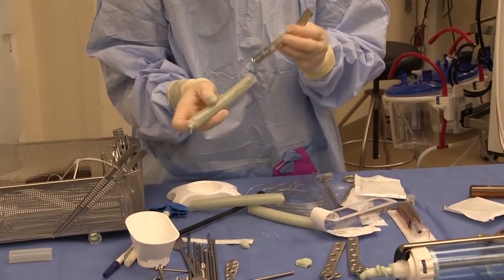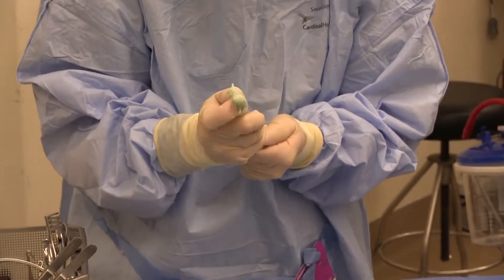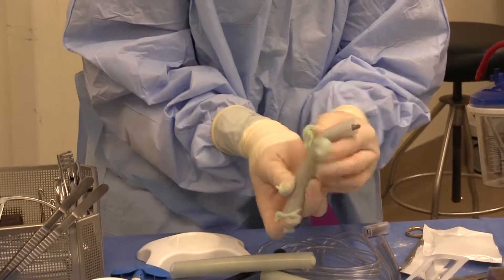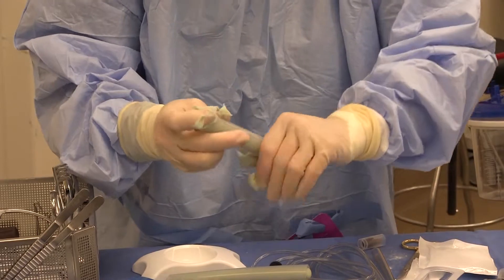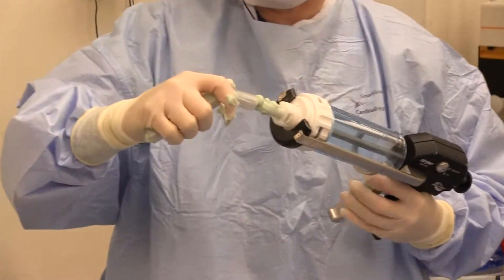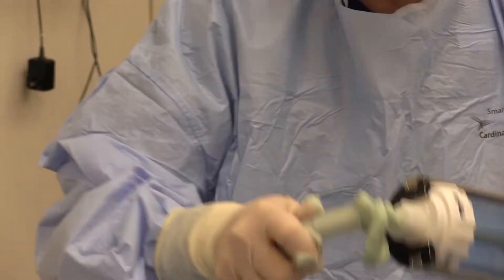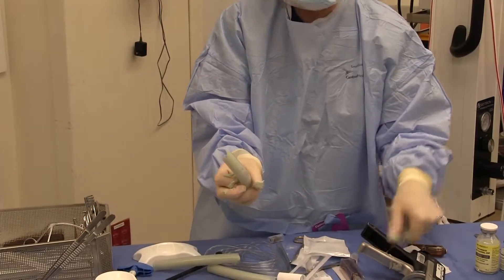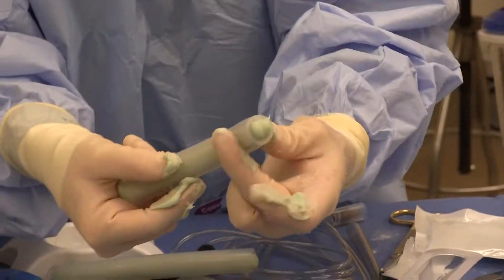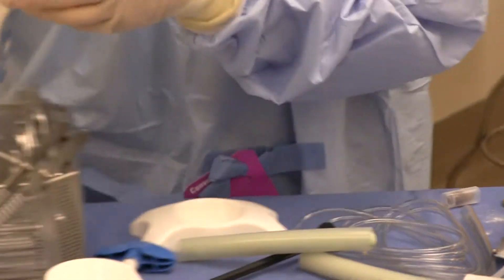This one is a little tricky because it's bent, and we may want to use a second piece of tubing. I can also see if I can inject this at the top here. The bend does make it tricky. So now you can see I have my tube filled with cement, and I have my plate pretty much coated.